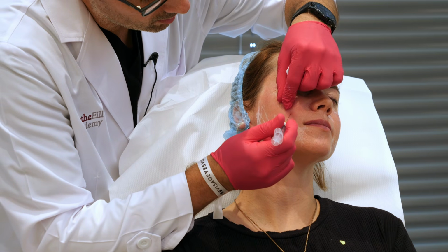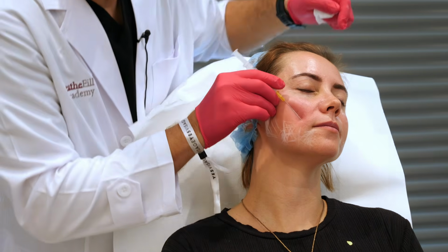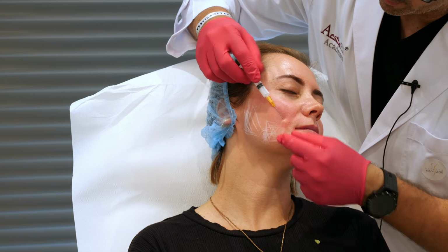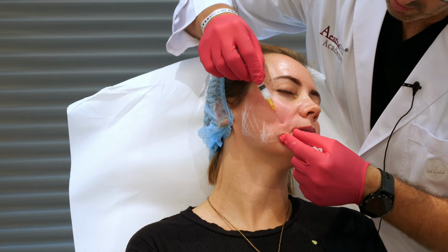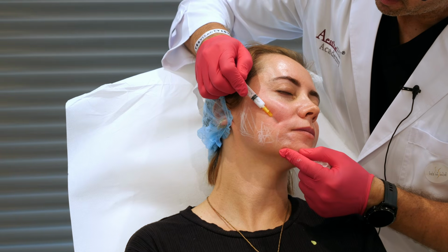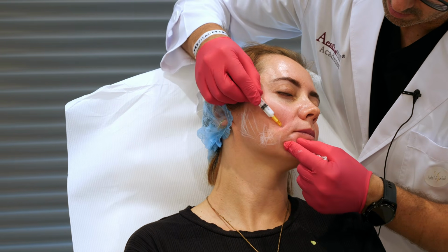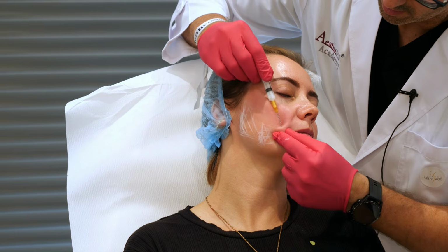I will open. We changed. Sorry, I'm right-handed. Here, slowly, it is an uncomfortable zone. I put a little bolus of product to promote the anesthetic, and another vector for this zone, a little.